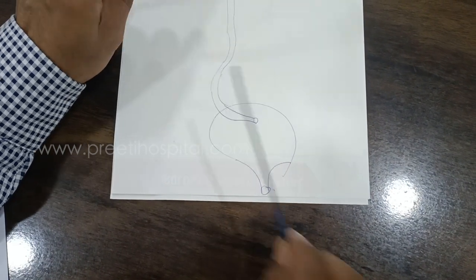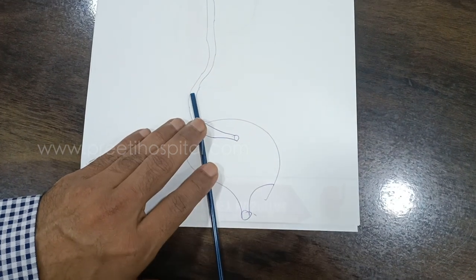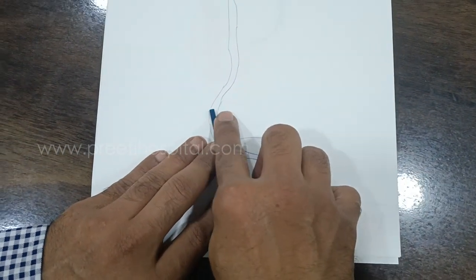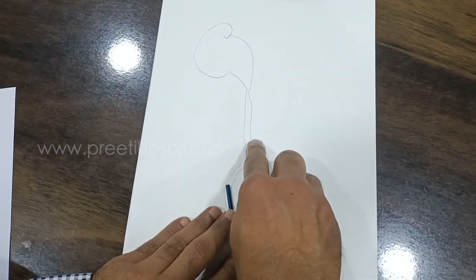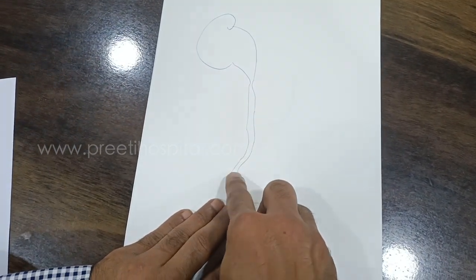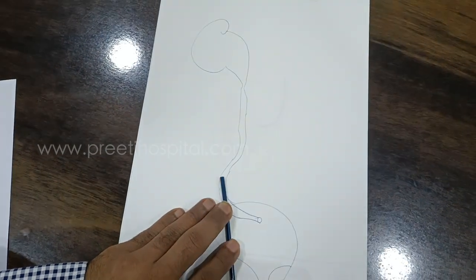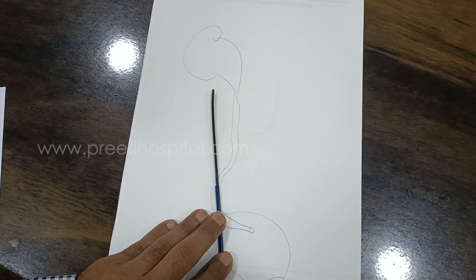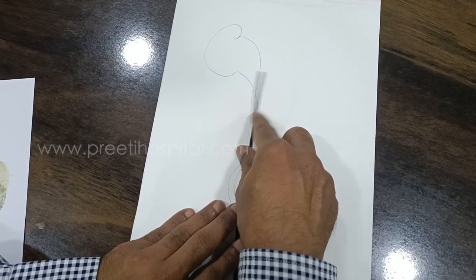Second part, if you keep the access sheet here with the flexible scope, here at this level, it is okay. What happens? Water will go and water will come out a little 30 seconds late and it will come out provided there is space between this. Where is the space between this flexible scope and the ureter? The space should be there entire length.